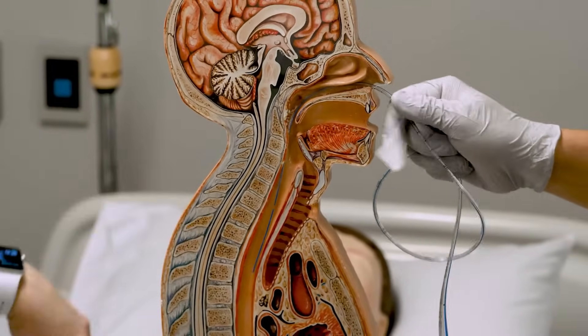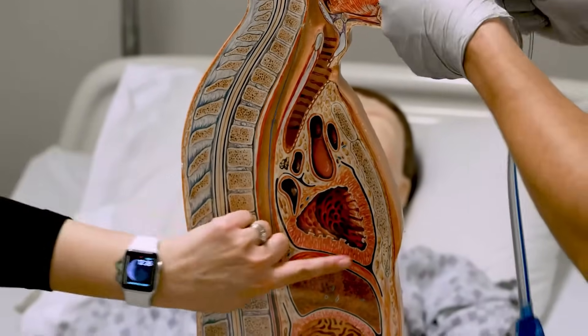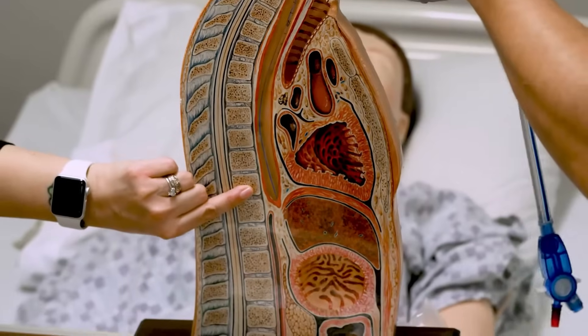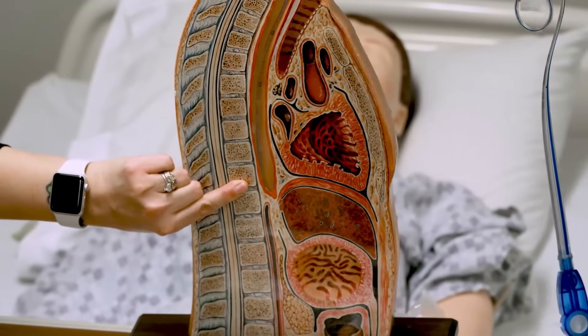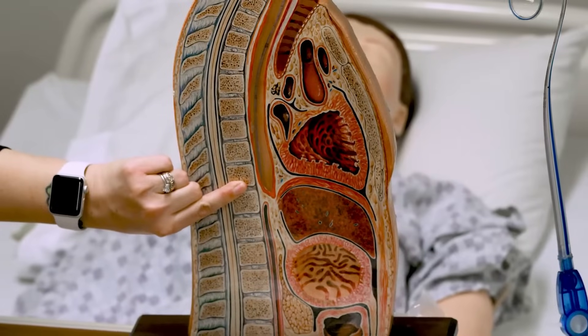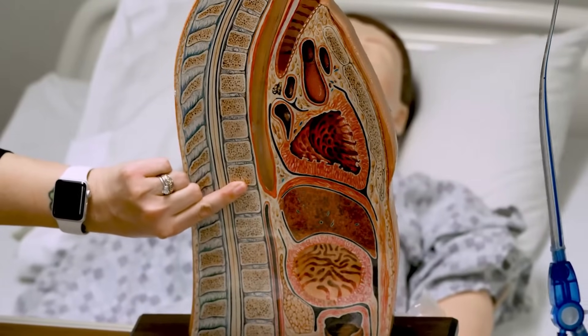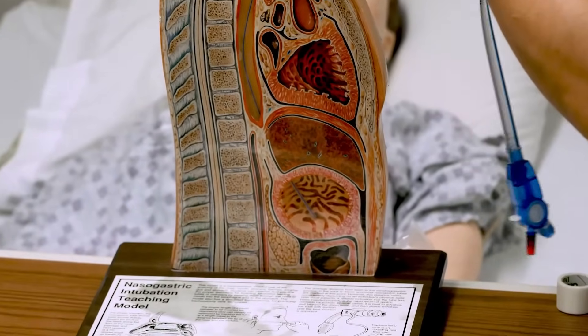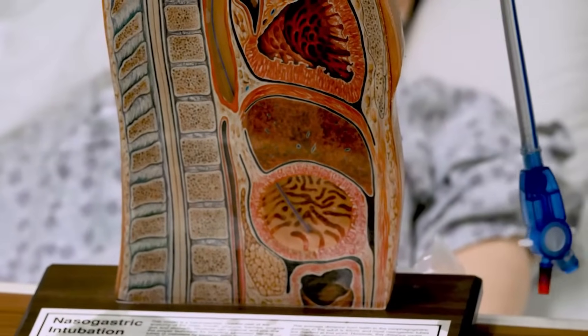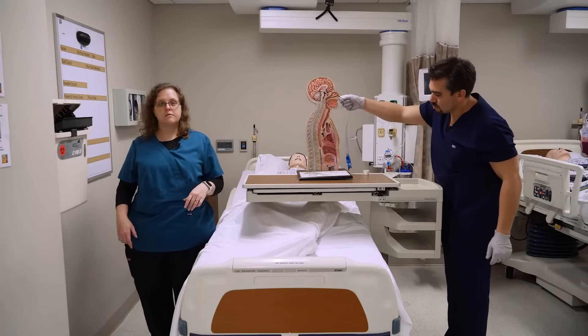We're going to continue passage here. You'll notice that this is about where the xiphoid process is. So if you measured there, your NG tube is probably going to be a little short and you've got a lot of other issues that you might have caused. So now we're going to go into the gastric area, and that's the length of the tube that we have. Then you would secure it at the nose.